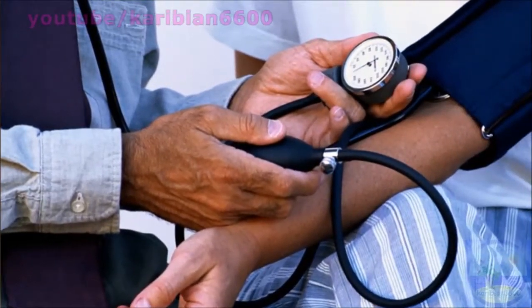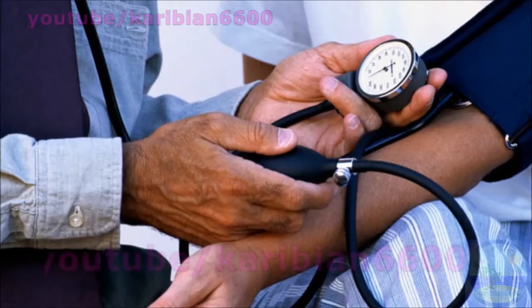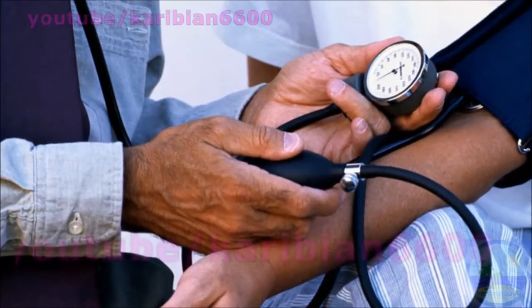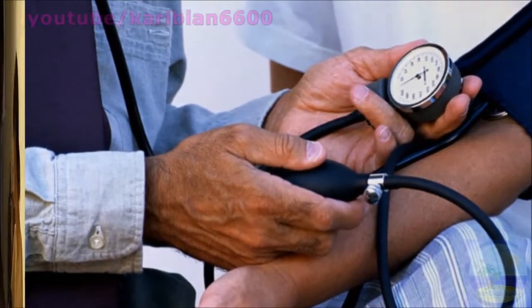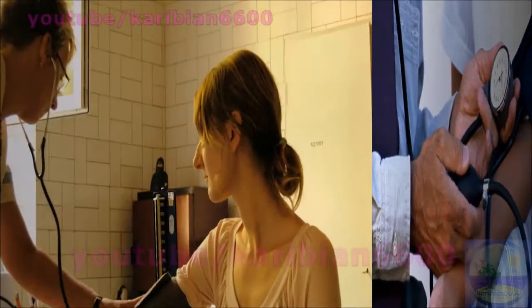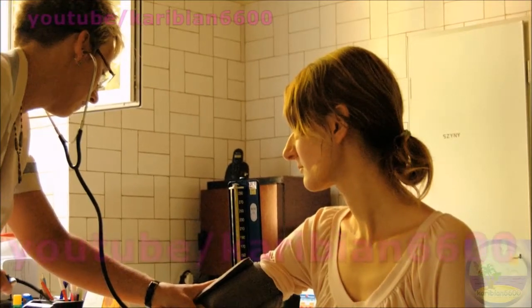The doctor pumps the armband up enough to squeeze the brachial artery in your arm shut. They then gently let a little air out and listen with a stethoscope at the crook of your elbow, until they hear the blood just start to flow again.